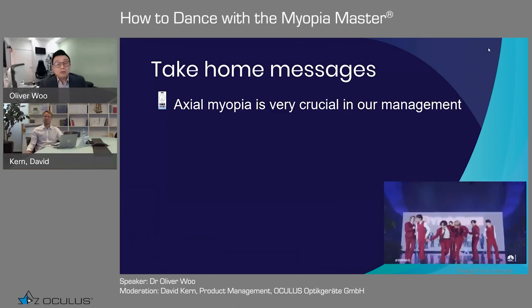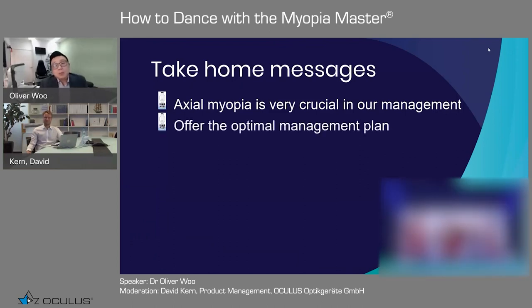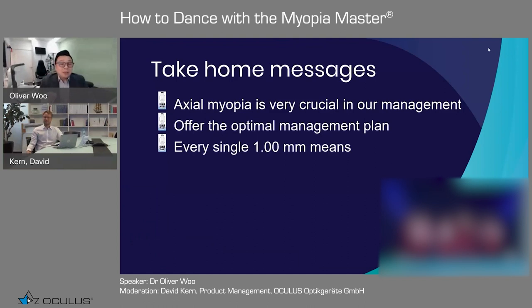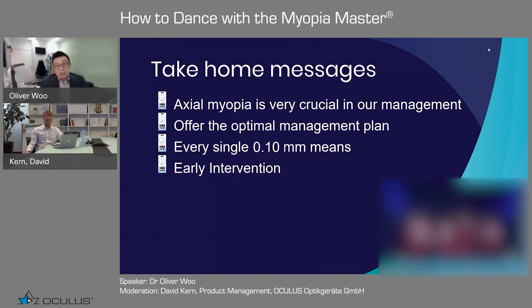That is something I love to share with you, just some take home messages. Axial length is really crucial in our management. We have to offer the optimal management plan to each myopic kid and patient. Every single millimeter means, actually it's not every single millimeter, it's every single 0.1 millimeter means. We want to do control down to 0.1. We need to change our thinking: every single 0.1 millimeter means something now. Early intervention.